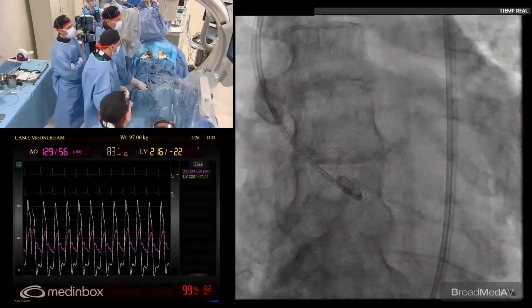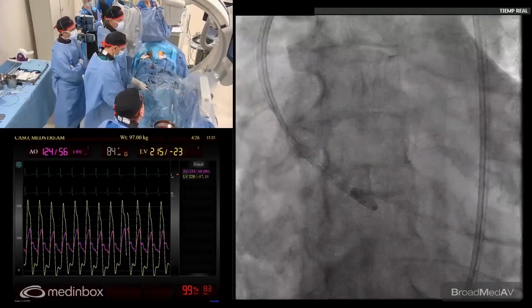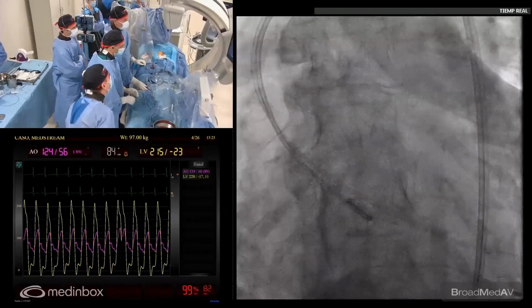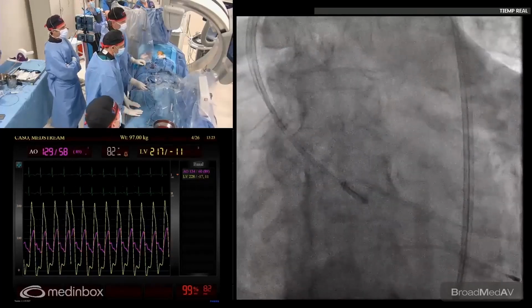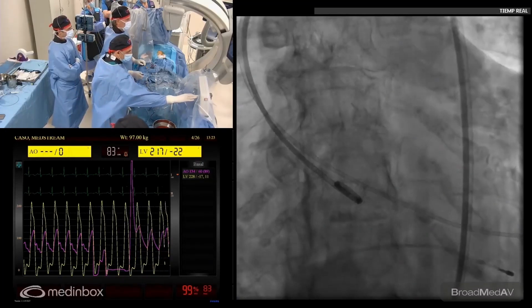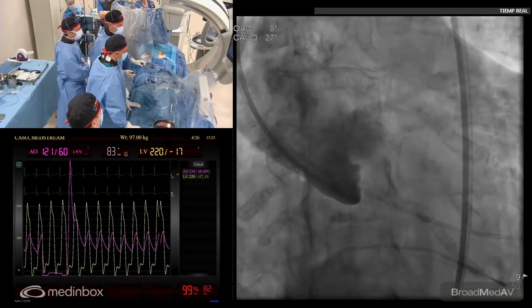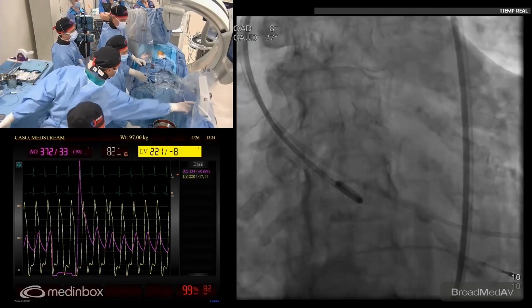So, working projection. We will do both. Okay, great. So we can see if we have both nice working projections. First of all, we go with cusp overlapping, which is 8 RAO and caudal 27. Let me check. I think it's a very nice projection. Maybe we can do another one because we have a lot of water in the system. Okay, beautiful. Let's go to the other.